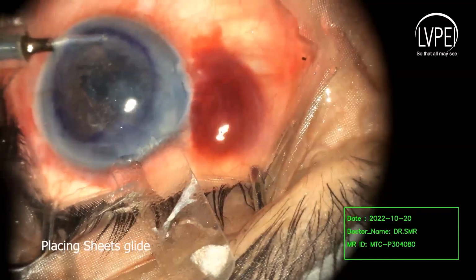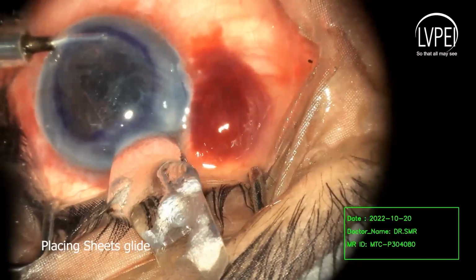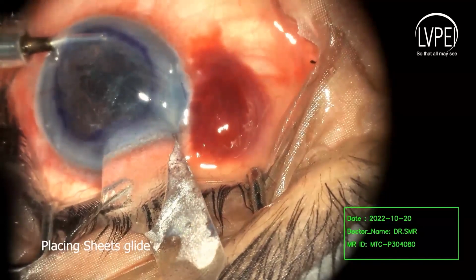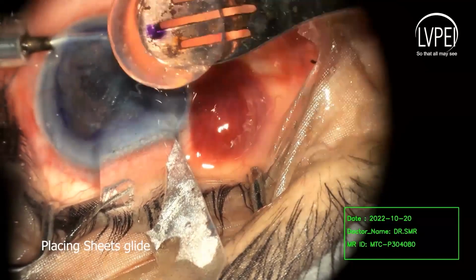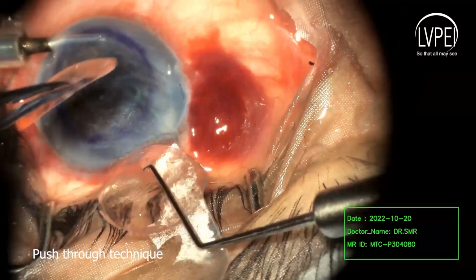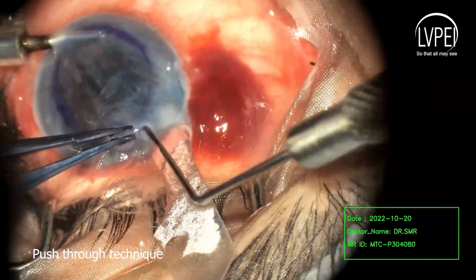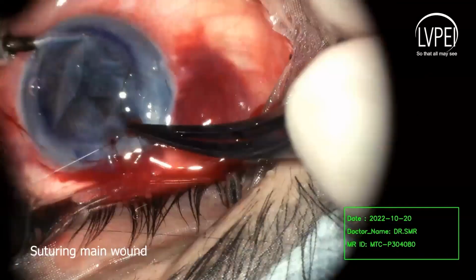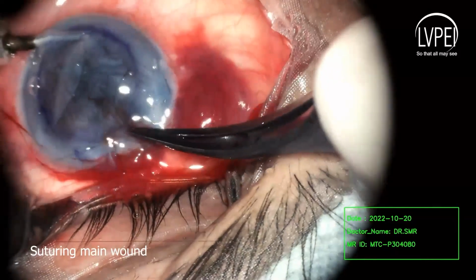The sheets glide was placed over the iris. The donor cornea was punched using a 7.75 millimeter trephine and then placed over the sheets glide with the endothelial side down over cohesive viscoelastic substance. The lenticule was separated from the cap and pushed over the sheets glide. The sheets glide was removed and the wound was sutured with 10-0 nylon sutures.